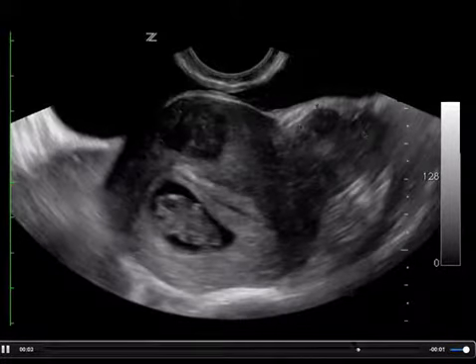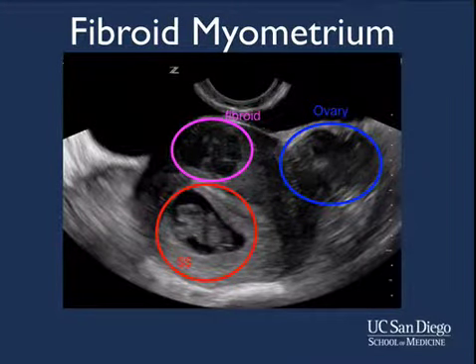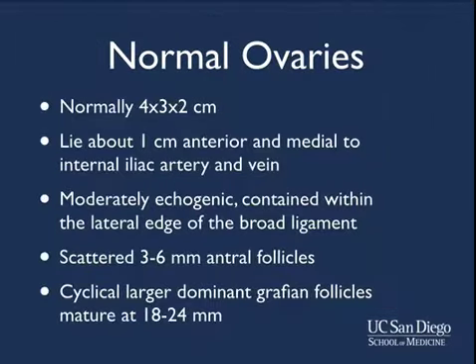Finally, in the adnexa, we notice the ovary. To identify these structures more clearly, I have outlined them here. The fibroid is seen as irregular density in the myometrium. Below this, we see the future medical student, and lateral to this, we see the ovary in the adnexal region.